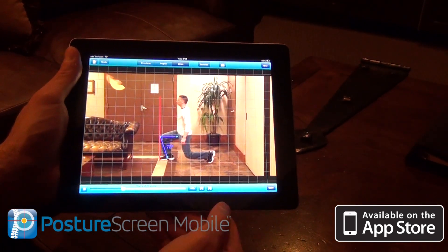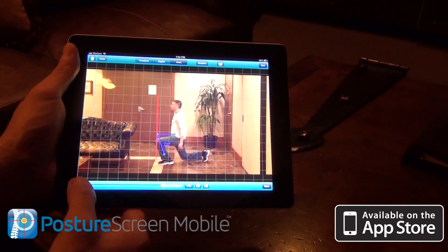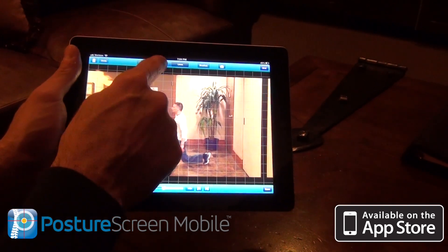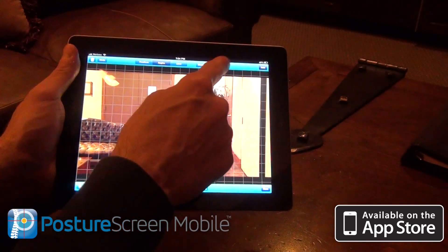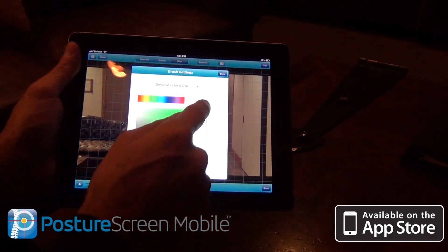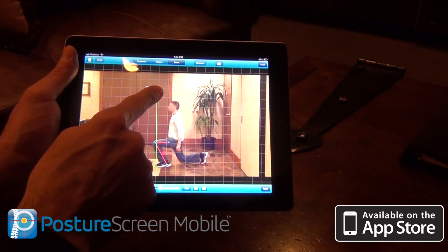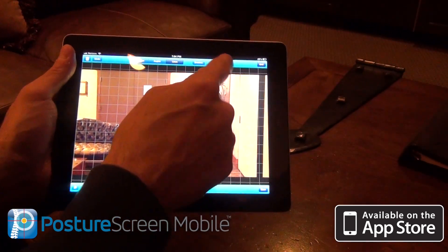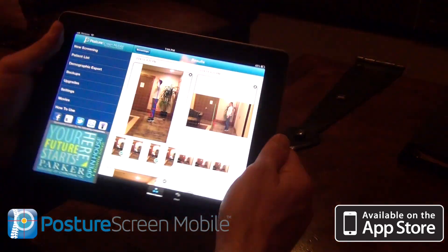We can go ahead and play this down, and if we want to, we can see how his other knee compares. We're going to do an angle here and take another picture. I'll switch it to the line, change the color to green, start at his toe and move up. Again, his knee is coming forward. Let's take a snapshot there. Now we're going to hit save and switch it back to portrait.